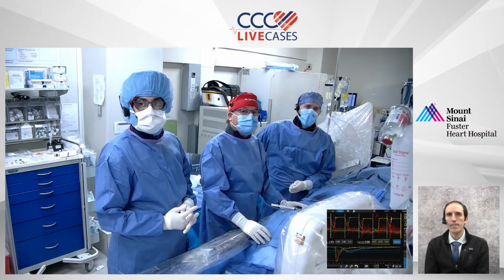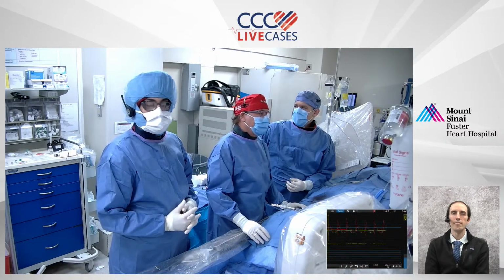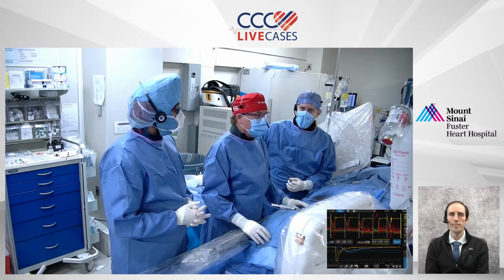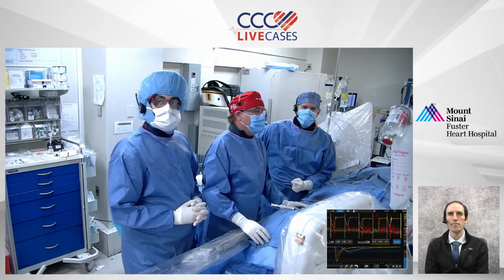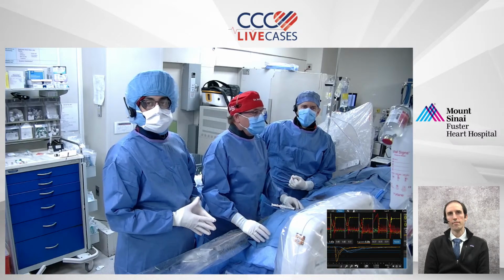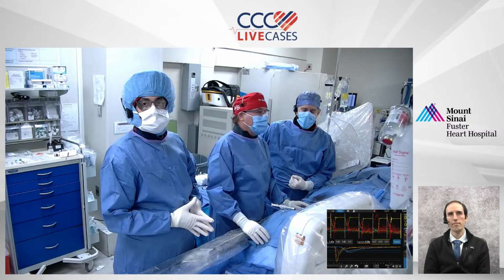Regarding the second question, there is a group of patients that I think we shouldn't be testing: the patients with extensive previously documented CAD with multiple stents. Some people use it, I have seen it, but we know that in diffuse coronary artery disease the flow is altered, and your CFR is going to be altered.